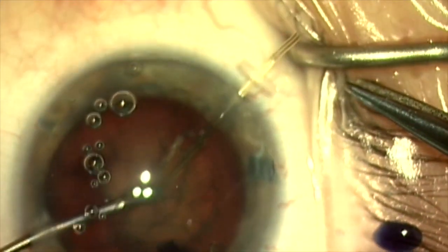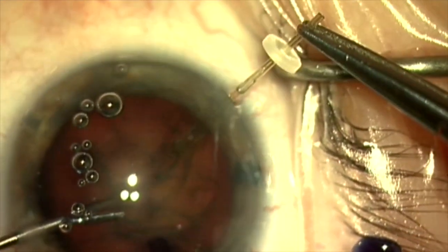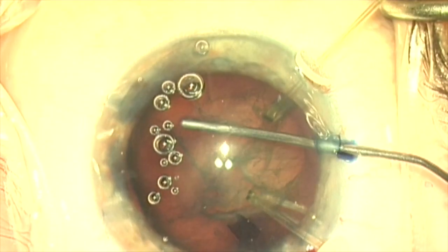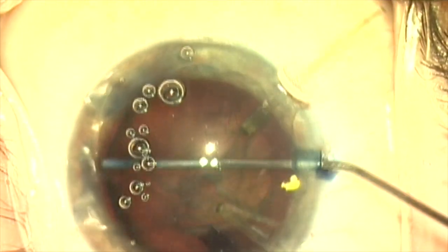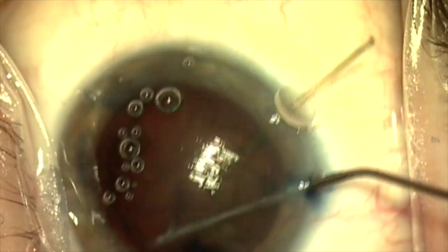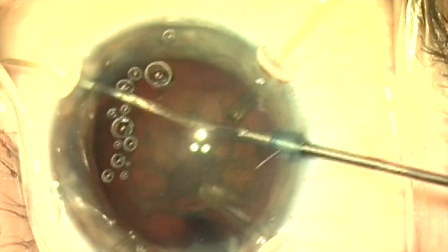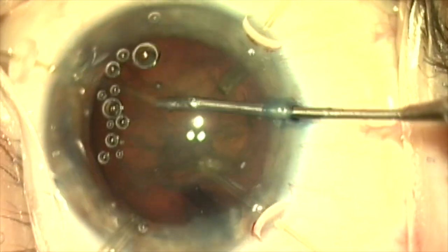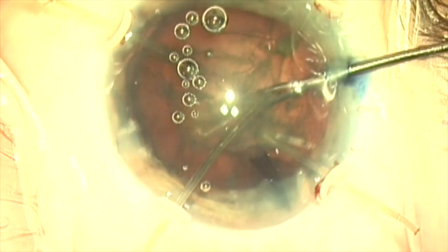I'm now going to place four capsule retractors at paracentesis sites, and I like to guide these into place from internally using micro forceps. Here we're putting a little dispersive viscoelastic in the capsule bag to inflate it on the side where there are no zonules, which will provide better control and more space. I'm going to grab the capsule retractor and position it using a 25-gauge micro forceps in my other hand.